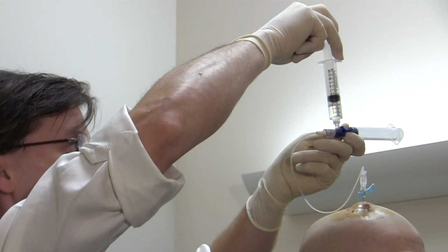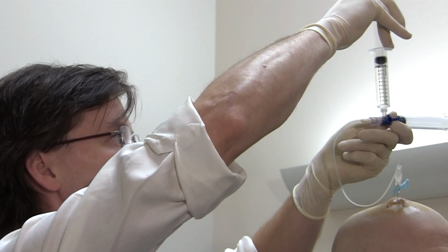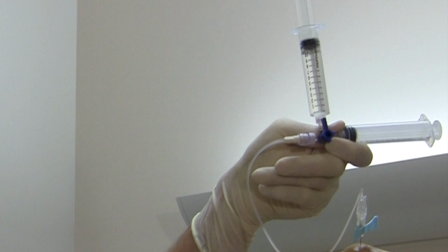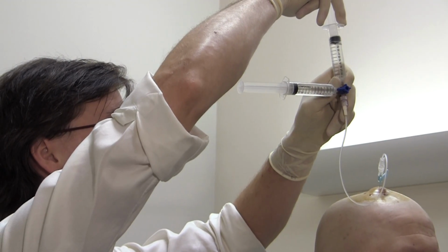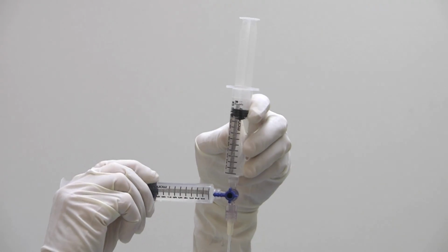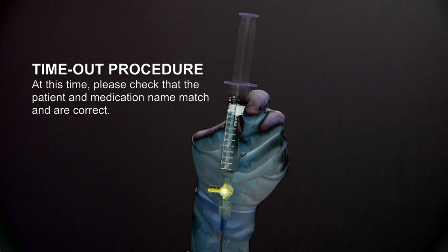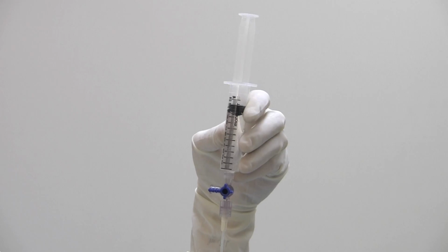Draw spinal fluid slowly into the upright 10 cc syringe. Once this syringe is full, rotate the stopcock to the off position and withdraw an additional 10 cc's of CSF into the second syringe. Remove the first syringe and send this fluid for analysis. Before connecting chemotherapy, perform a timeout, verify the patient's name, date of birth, and that the drug is suitable for intrathecal administration.